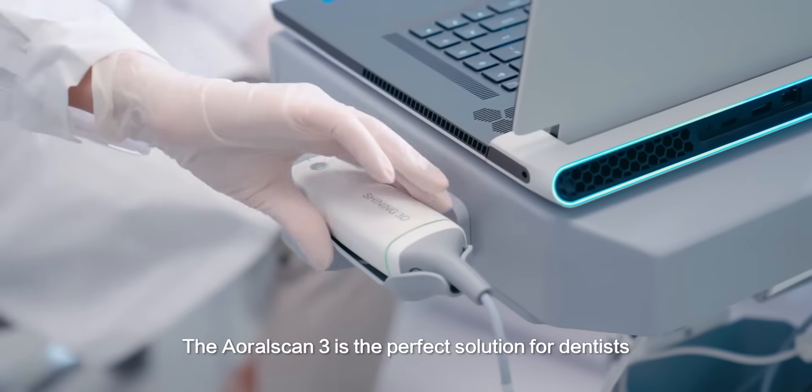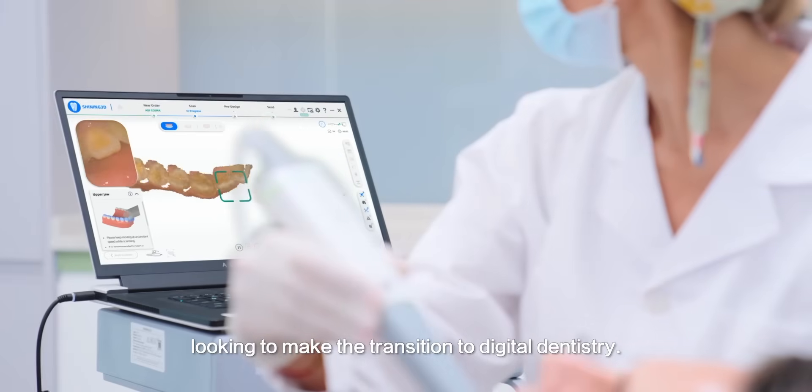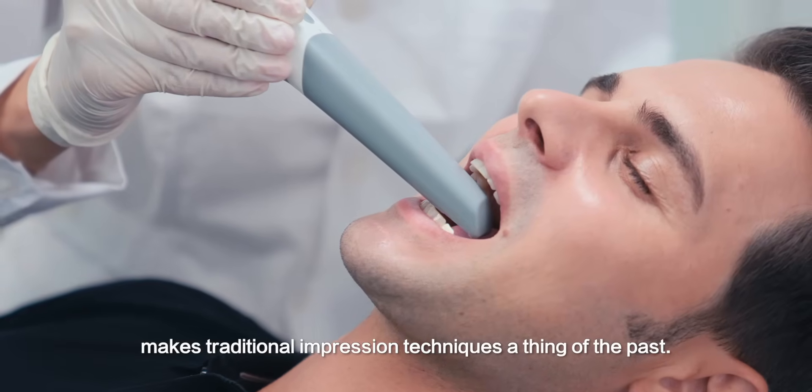The OralScan3 is the perfect solution for dentists looking to make the transition to digital dentistry. The elegantly intuitive design makes traditional impression techniques a thing of the past.